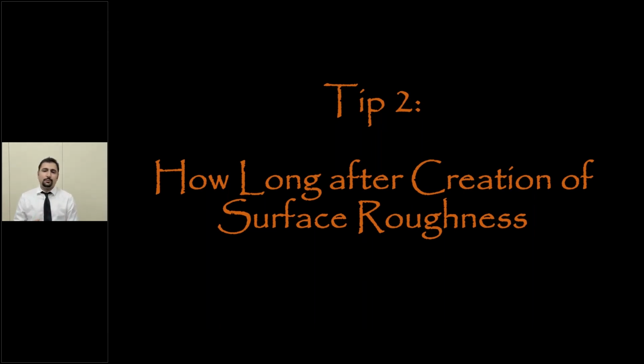If I ask my lab tech to sandblast it for me, and the lab tech is in New York, they're going to mail the crown to me. It's going to take a couple of days to get here. I'm going to open it, and then I'm going to try it in the mouth. Really, am I getting the same bond as if it was sandblasted right away, right now? Let's answer that question.